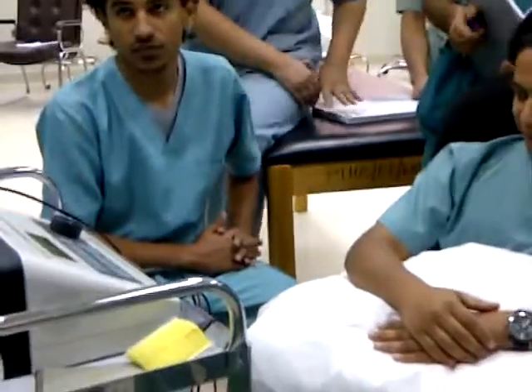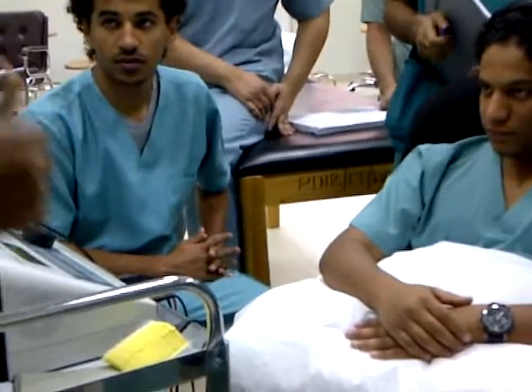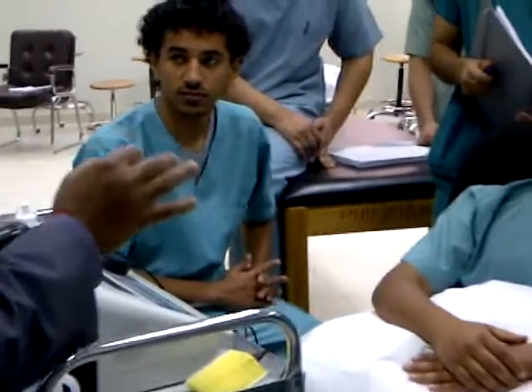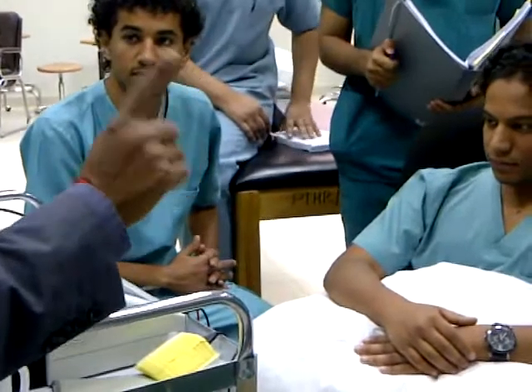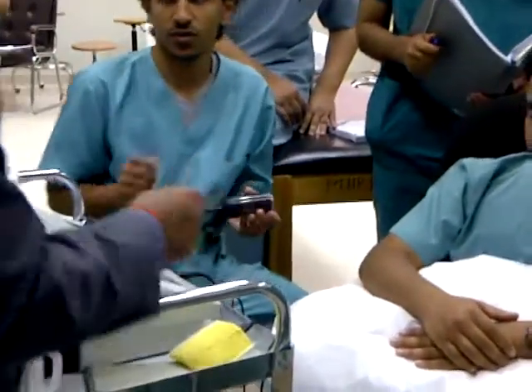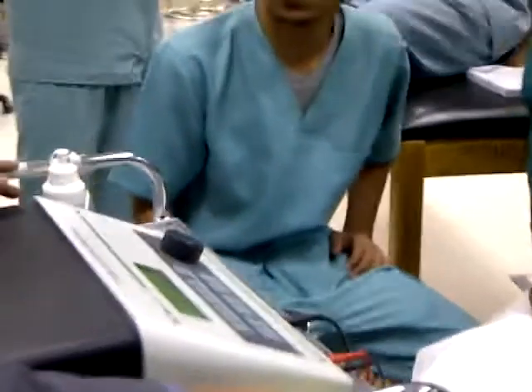So always try to maintain comfort. If the patient is 100% comfortable, the treatment will be 100% successful. More benefit, the patient will respond to your treatment. Otherwise there is no response, no decrease in pain or symptoms. Then you take the history. Before starting, what do you do? Check what tests you have done.